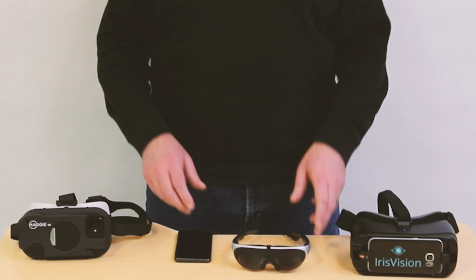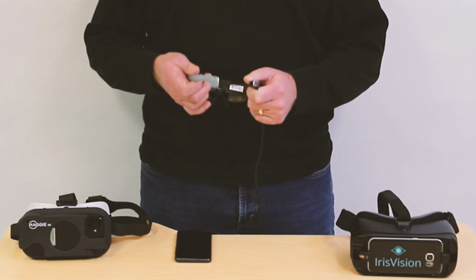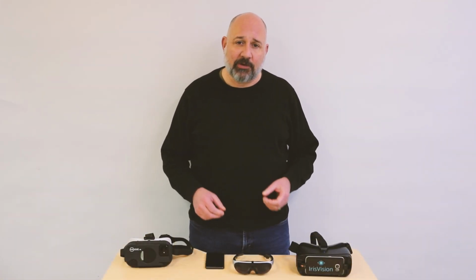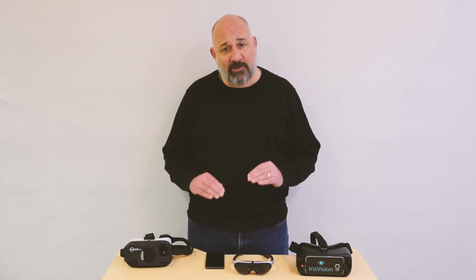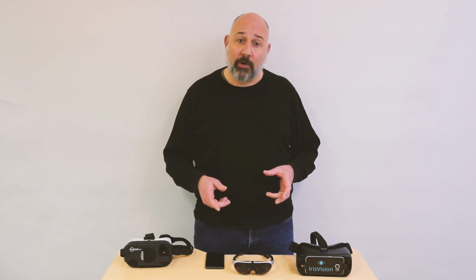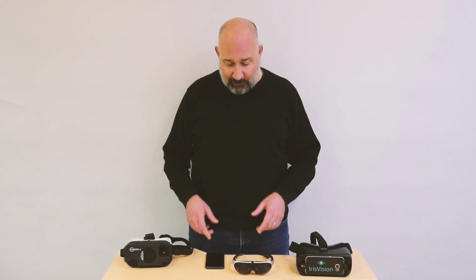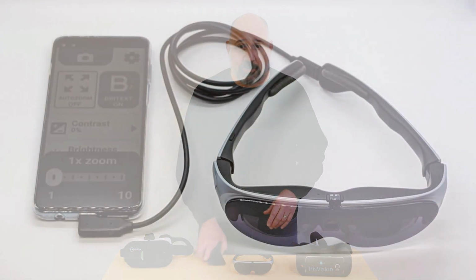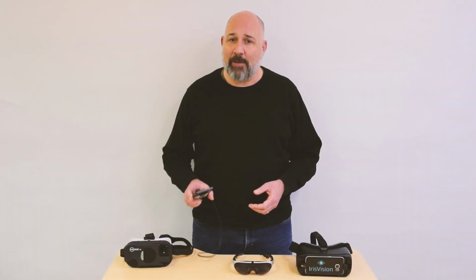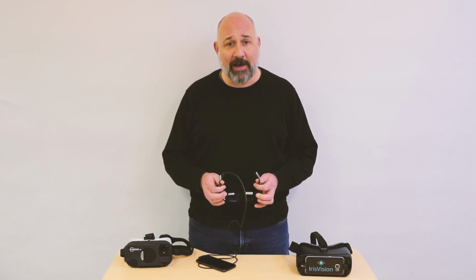These types of devices use a combination of a camera and two very small screens that are presenting the same image to the wearer's eyes. The image is being processed live so that you can do image enhancement, high contrast, and on some products, use optical character recognition to read text to you, or artificial intelligence to ask questions about what you're looking at. Sometimes these features are built into the unit, and sometimes these features are loaded into a cell phone with an app. How the work gets done doesn't really matter. What matters is those two small screens and how they're positioned directly in front of the eye.